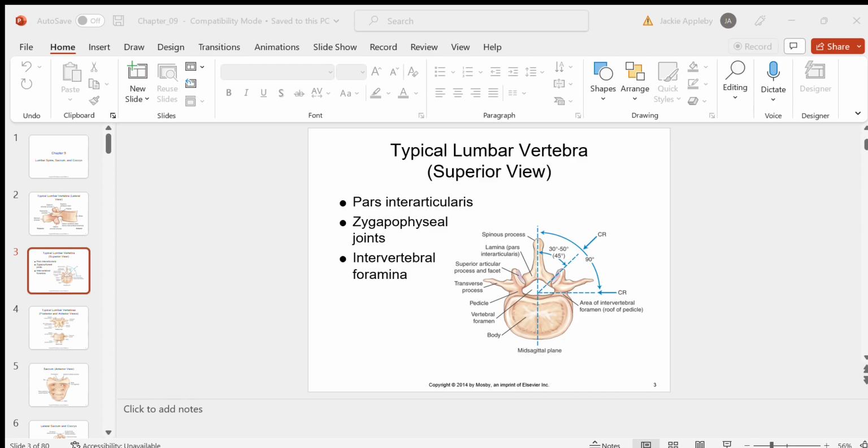That's their articular facets, meaning that you have to rotate the patient. Imagine this being the patient. You'd have to rotate that patient in the thoracic spine 60 to 70 degrees until that joint space would be visible. In the lumbar spine, it's about 30 to 50 degrees. Less angulation, a shallower angle, the lower you are in the lumbar spine.